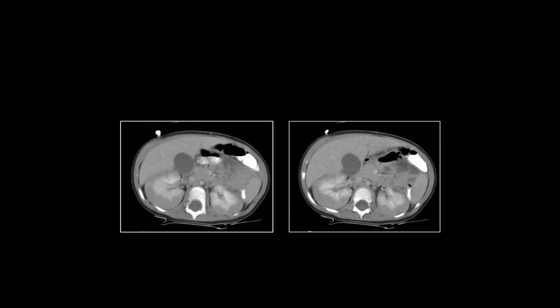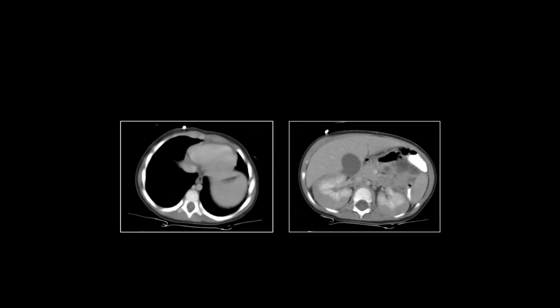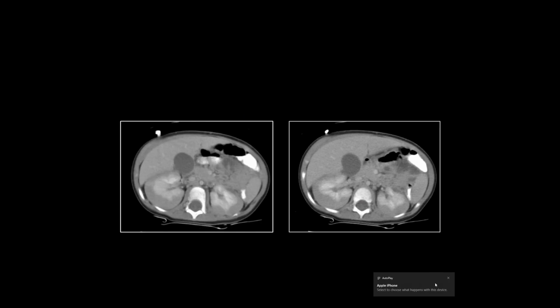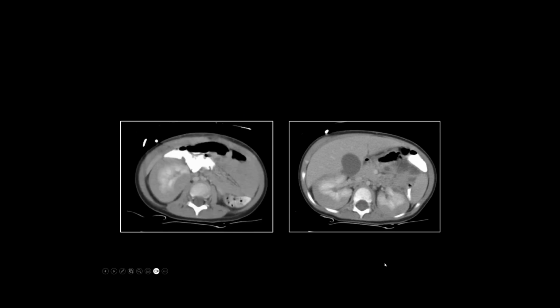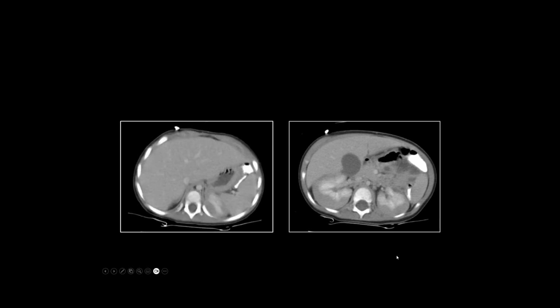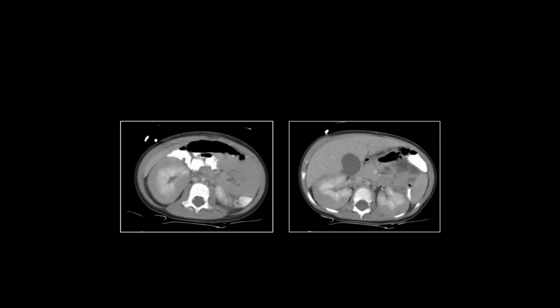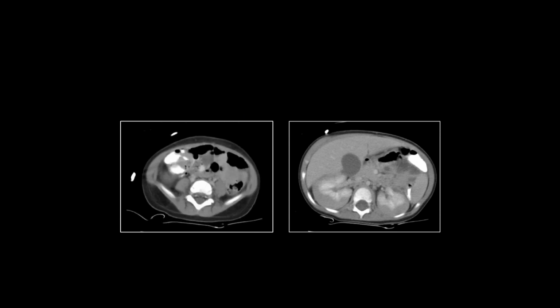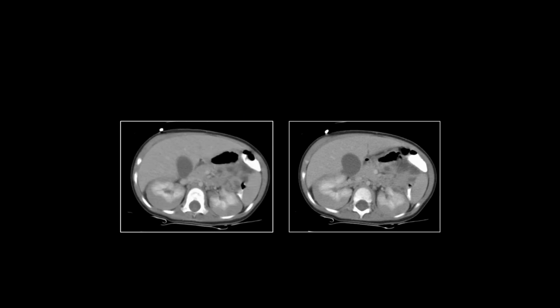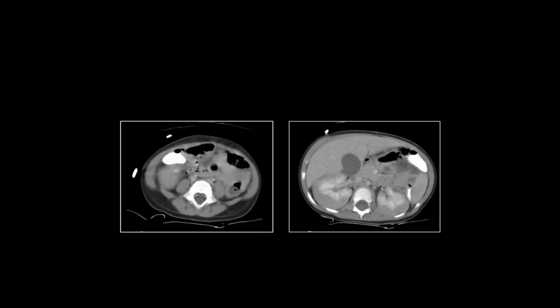That one's crazy. If you haven't seen it, this is one of those that has just a very characteristic appearance, and forevermore you will know this one. I will tell you, oftentimes I show this to residents, and their first guess is bilateral subcapsular hematomas. It's possible, but it's so homogeneous and so extensive and so bilateral that it is extremely unlikely, right?